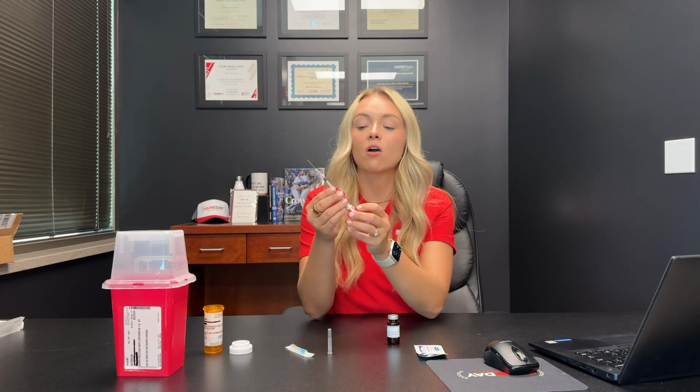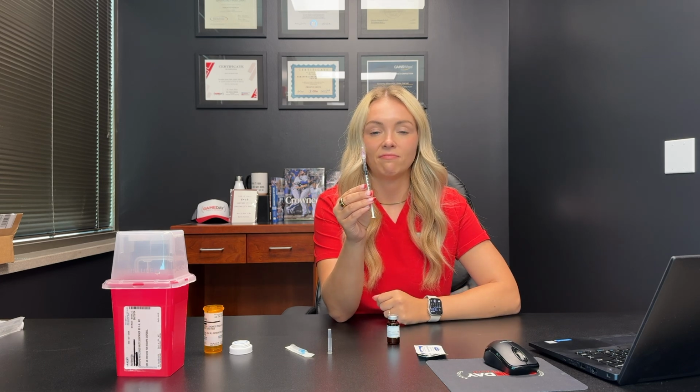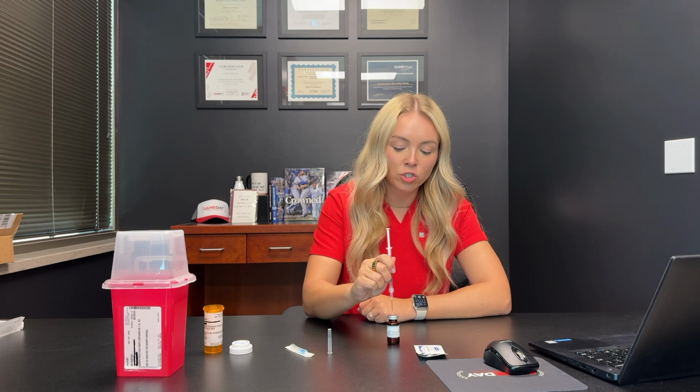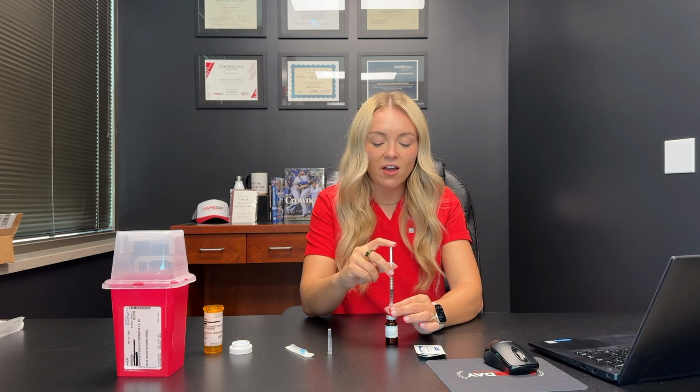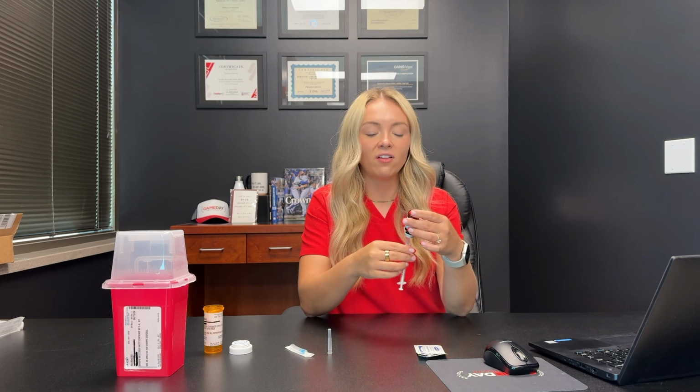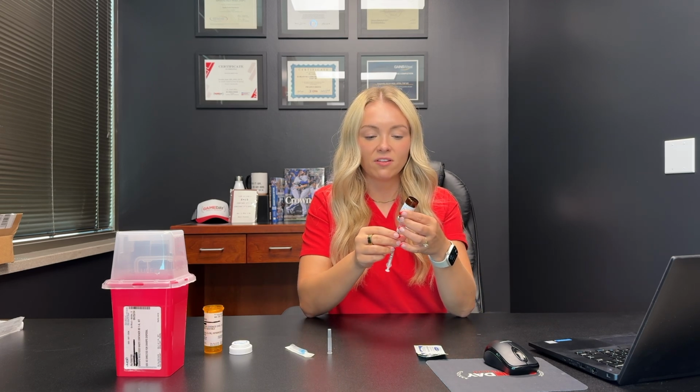So I'm going to draw air into the syringe until I hit 0.4 mLs. Then I'm going to take the syringe and the needle and go straight into the vial. Next, I'm going to push the air that's in the syringe into the vial. Then I'm going to flip the vial and the syringe upside down.